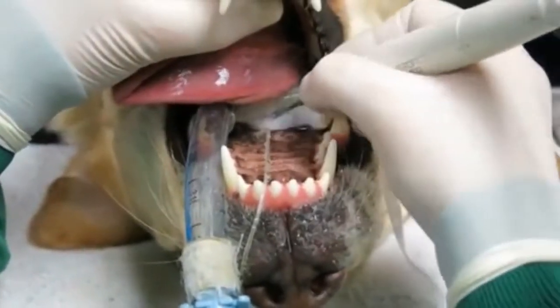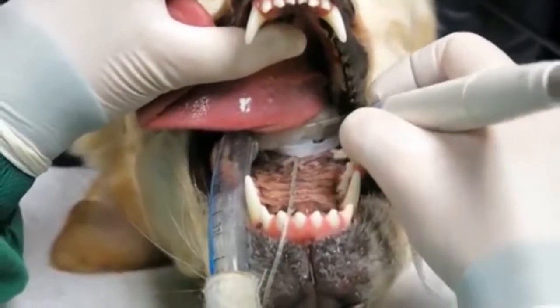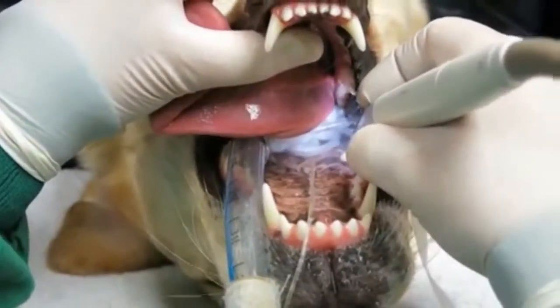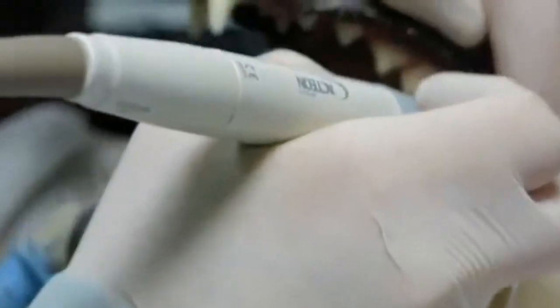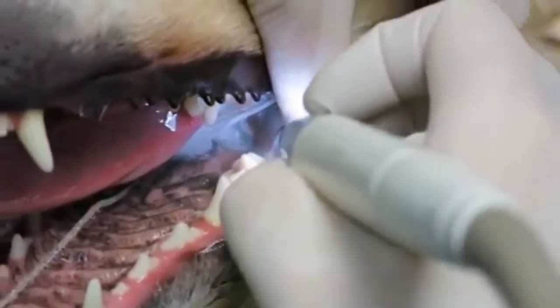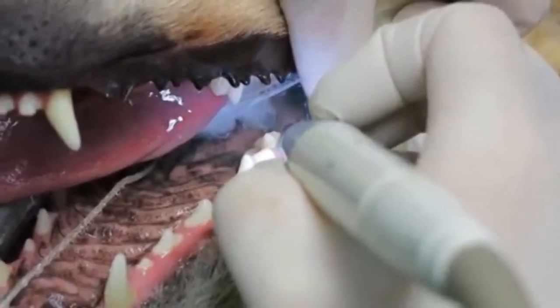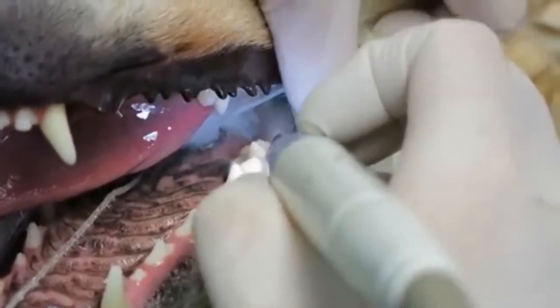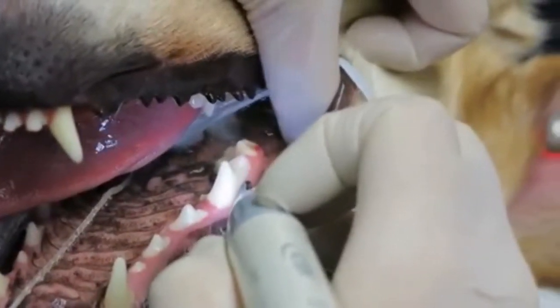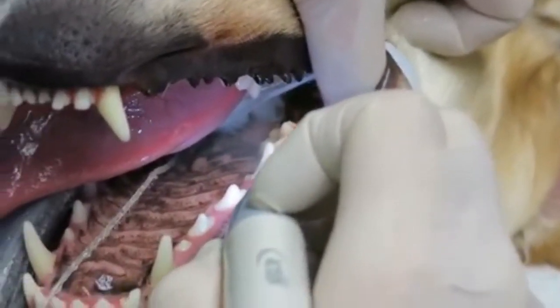The gauze at the back is to stop any tartar chunks going down into the lungs through the trachea and the back of the mouth. I've had a look at the x-rays and it looks like we've got stage 1 periodontal disease — this is when you really want to be doing this. Now I'm going to go under the gum line and clean the pockets, called the sulcus because it's normal, but I'm going to take away all of the tartar from underneath the gum line with this ultrasonic scaler.